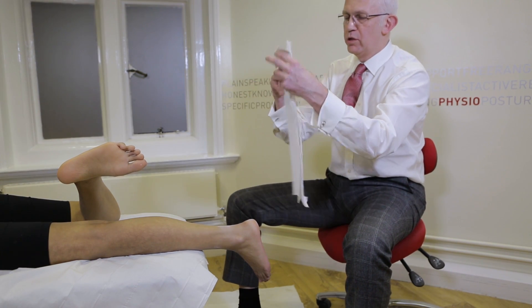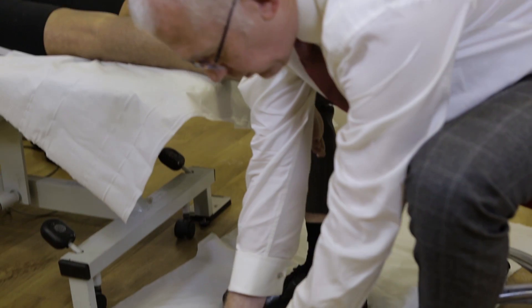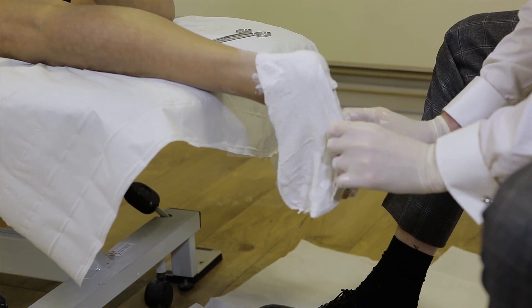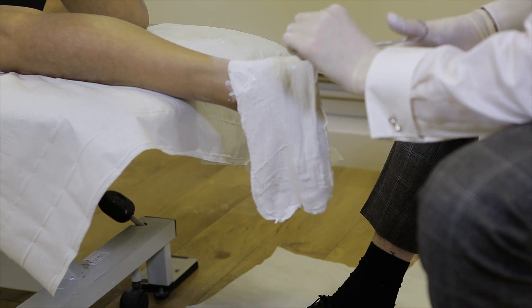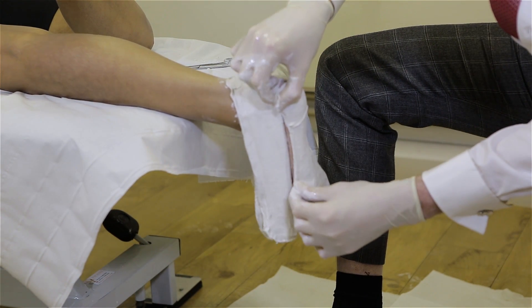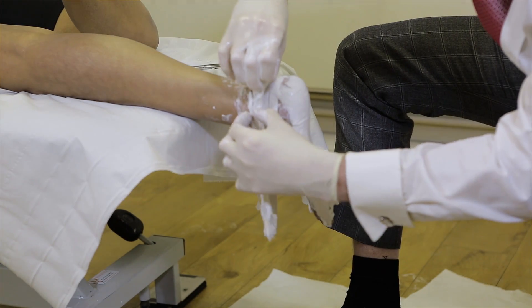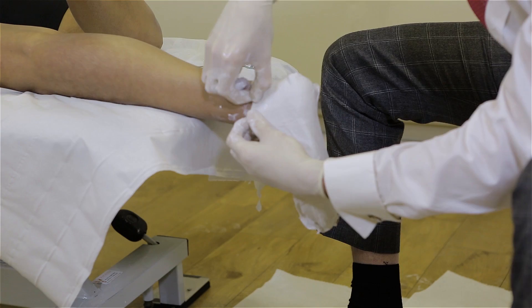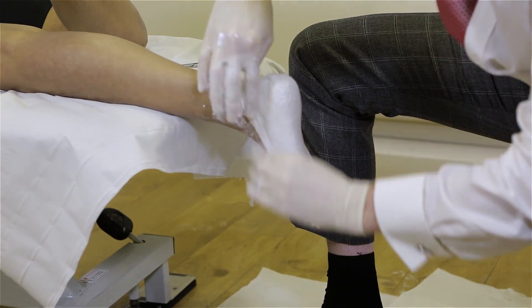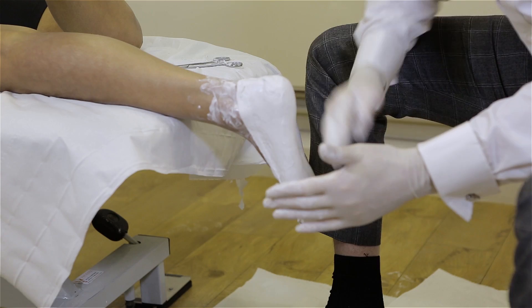So let's get ready to do this cast — it's always the nice messy bit. I tend to use my fingers to keep a couple of layers of the plaster, getting that nice and wet. I'm now going to place that over the foot using my original dimensions. I'm then going to take my scissors and cut straight up to the heel. I can fold that away, and now you'll see I can bring this bit of plaster of Paris all the way around so it makes one contact with the foot. I can then bring my lateral piece back round to cross over. It's quite nice if you can capture the lateral malleolus, as some labs like to use that as part of their balancing technique. I tend to fold down slightly so that it gives a little bit of resistance and support to the plaster of Paris, and I'm now going to smooth that over.